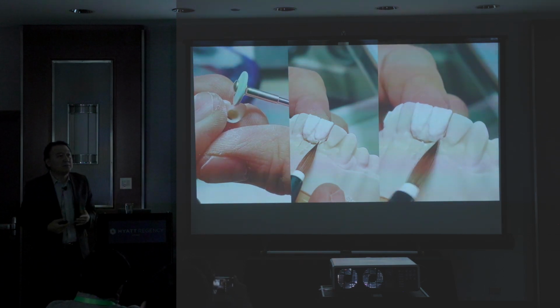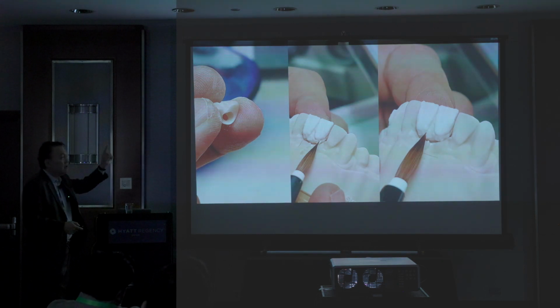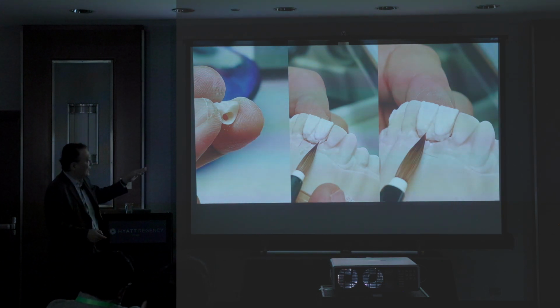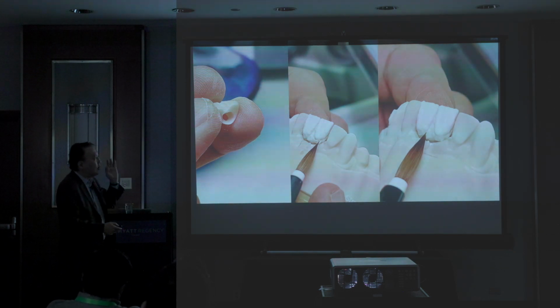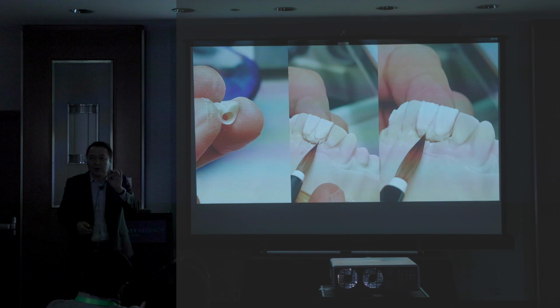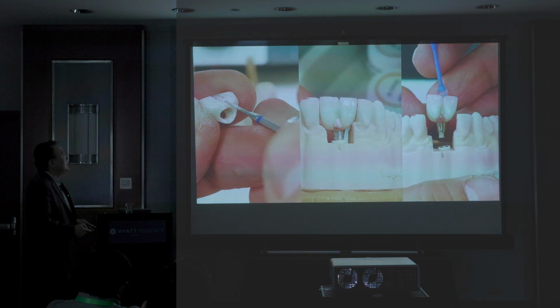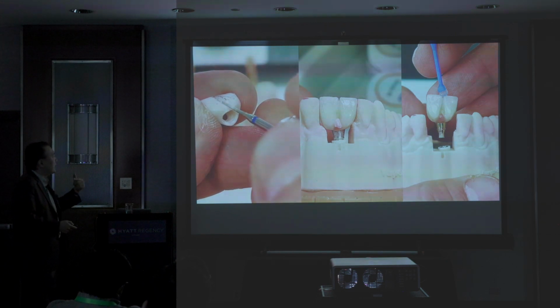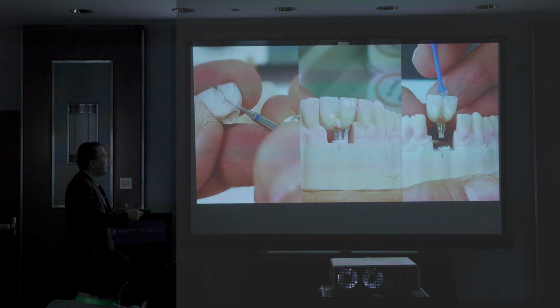Depends on the case. I'm thinking, and then I'm trying to share with you guys from the value. I want the value. And then I can apply a slight dentine, very light, and a couple of enamel and pink color. That's it. All right, so here is the thing. After that, I contour one more time in pink, because pink shrinks.